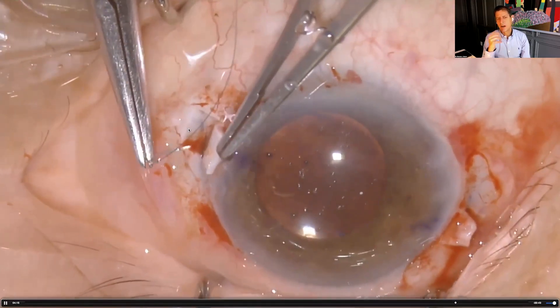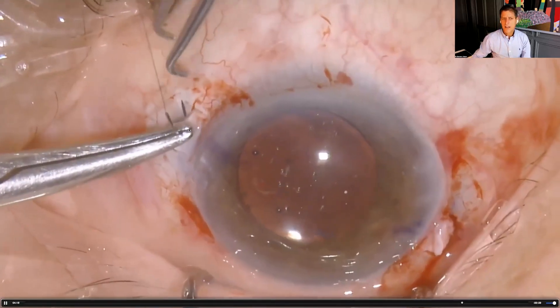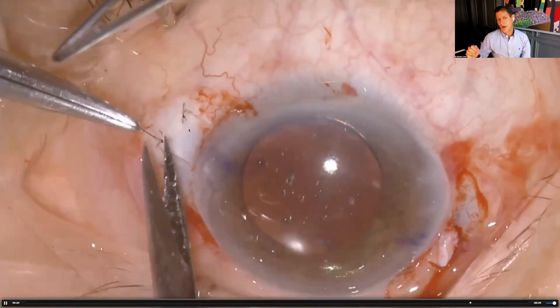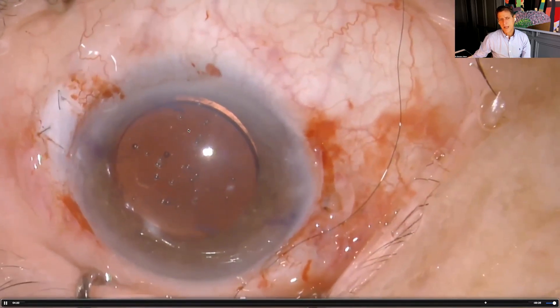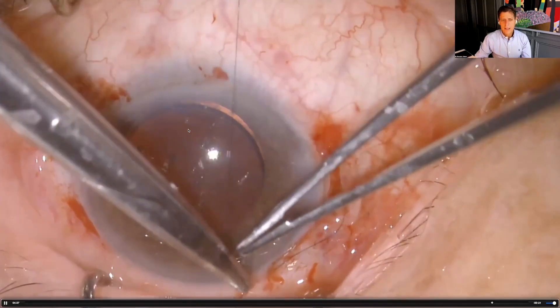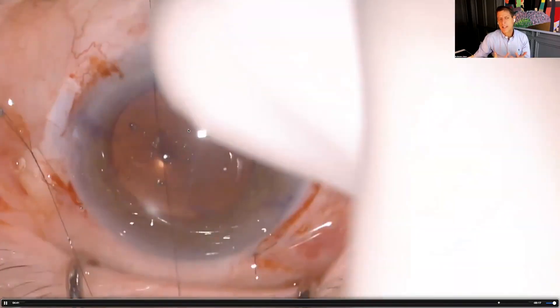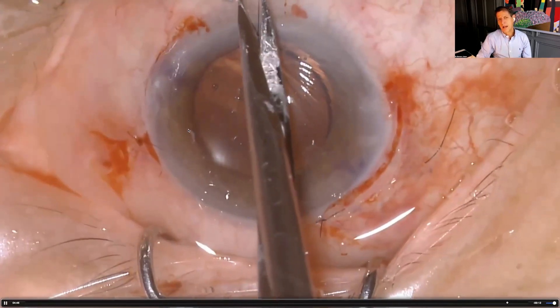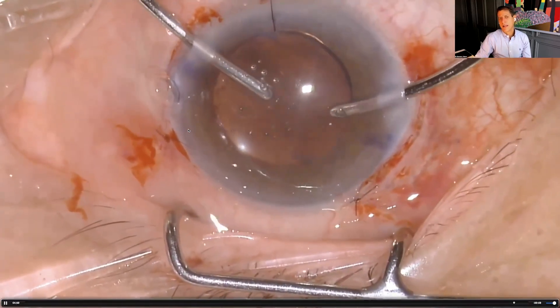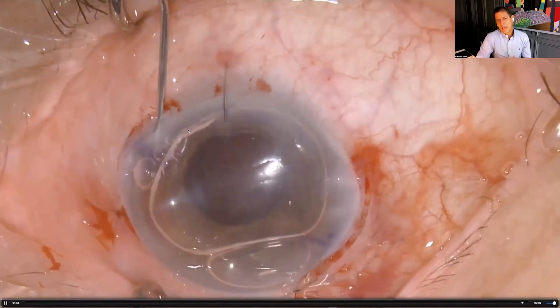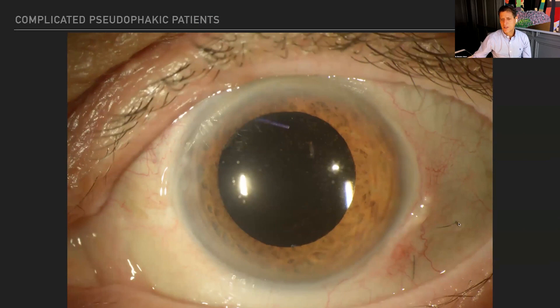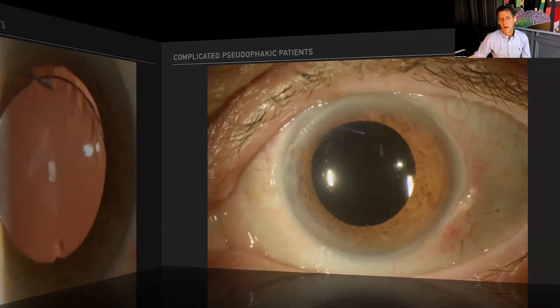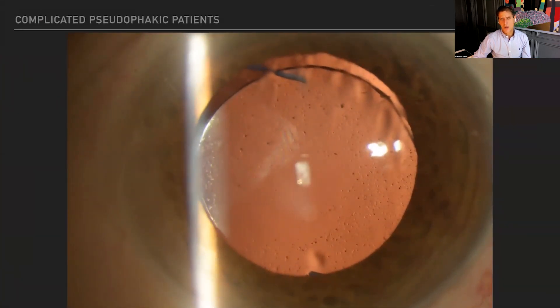The lens goes in very easily. We then do our X-suture technique: go underneath the lens for one pass, then a second pass to close the sclerotomy and hold the lens in place. We close the sclerotomy and conjunctiva. On aspiration of viscoelastic the lens sits exactly where it should be, not moving forward or backward. I sometimes inject a small air bubble to confirm the lens is fixated. Postoperatively, the sutures closing the sclerotomy are visible, the PVDF haptics transilluminate through the sclera, and the lens is well centered.